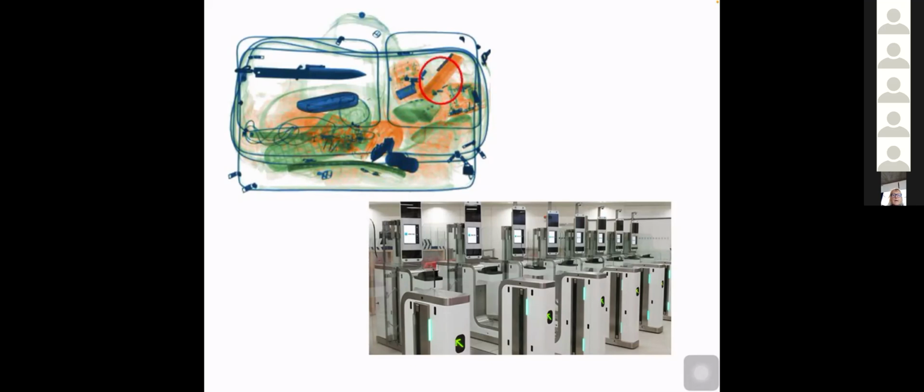Customs officers look at your bags and there's a circle for high risk particular areas. But if we think about the jobs that we do, there's lots of things that the digital landscape of the future in pathology will let us do much more easily. I really don't want to spend 45 minutes looking for a single acid alcohol fast bacillus, a mycobacterium on a Ziehl-Neelsen. If I can have any suspicious areas on a ZN highlighted for me quickly, that's going to save me some time. I only need to see one decent TB organism to say I've seen a mycobacterium, and that sort of technology will make my work easier.